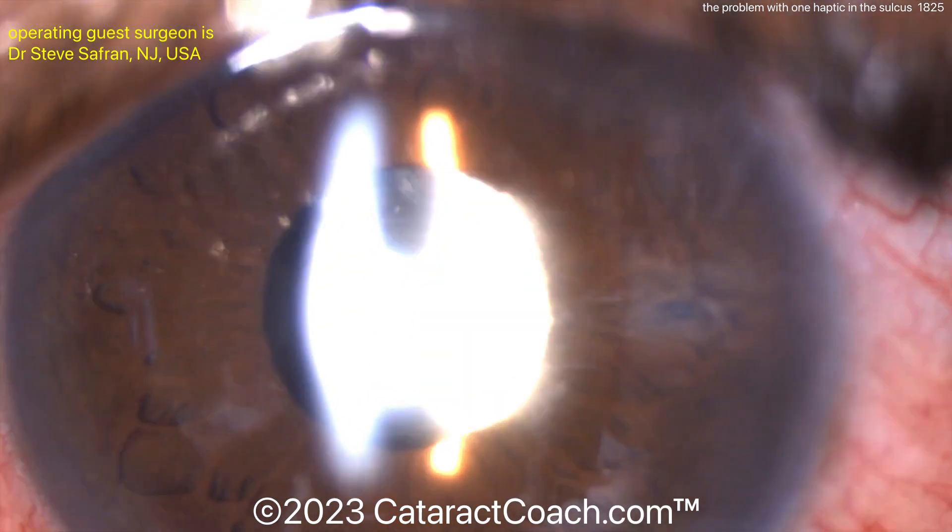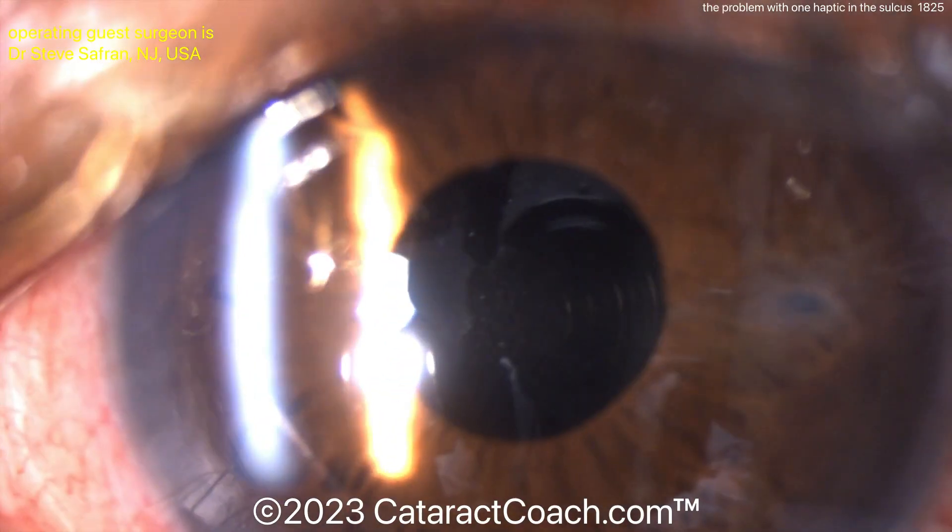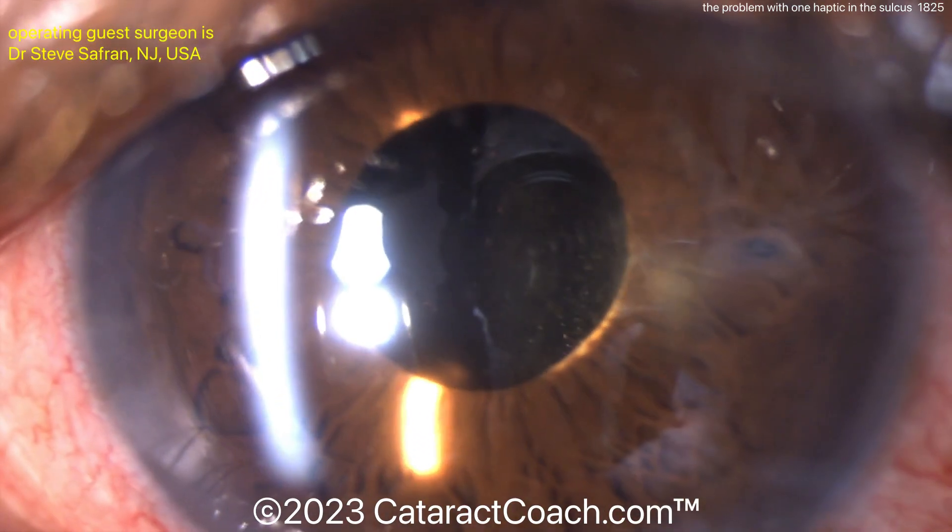Let's take a look at the post-op picture. Post-op day one: nicely centered, quiet eye, beautiful outcome. So be very careful with haptic positioning.